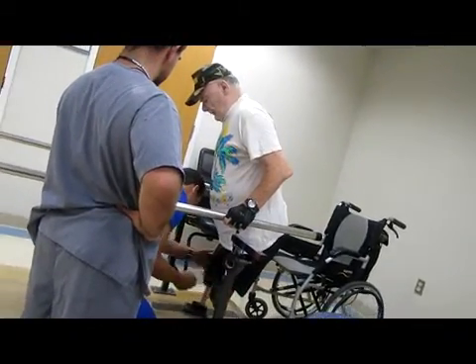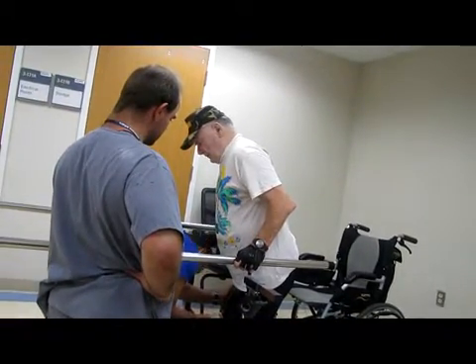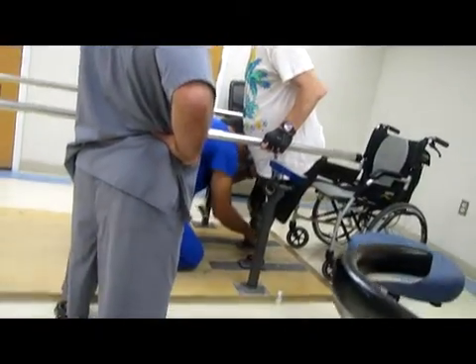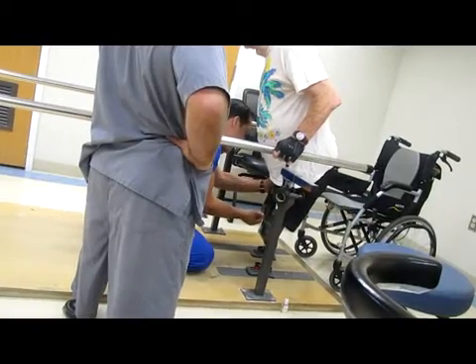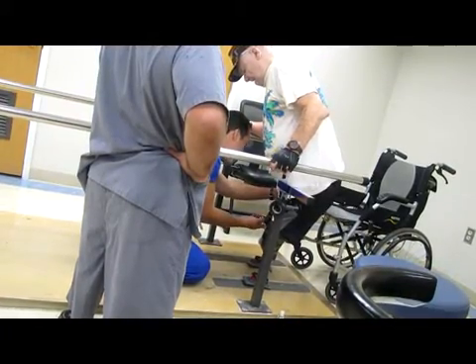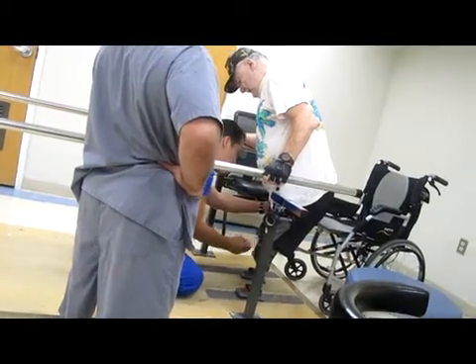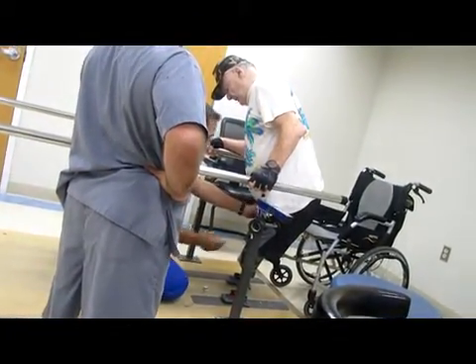Yeah, it's a little painful in the right one. Where at? Specifically at the end? No, the right one you're not down in yet. It's kind of near the end, but can you get down further? Because you're not down in yet on the right at all. You're off the bottom. Okay, well maybe the sock isn't going to work on the right side. Maybe not. I've got the majority of my weight on it.